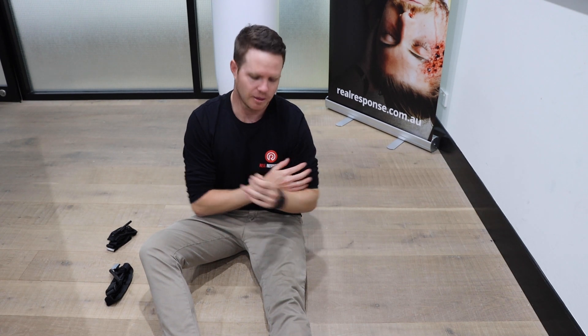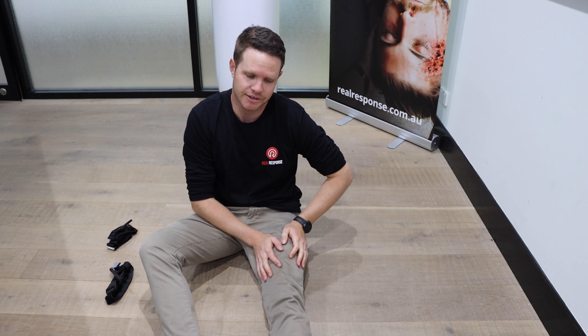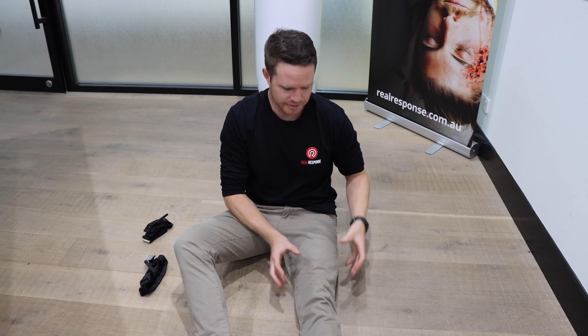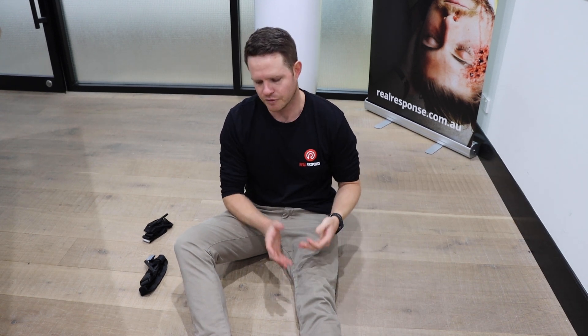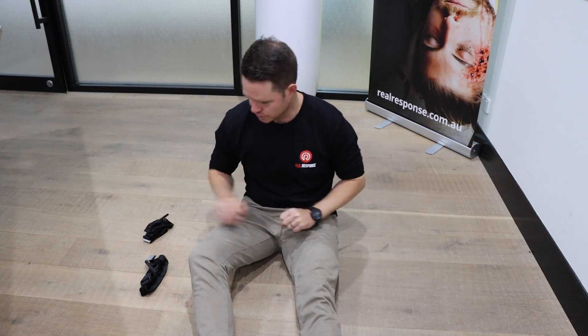The same principles for the arm apply exactly when you put it on the leg. Just be aware that the muscle in the leg is a lot larger than the arm. We may have to apply more than one tourniquet to the leg. If you have a double amputee and two of you are working on that patient, make sure you're pulling that tail away from each other, not towards each other - pulling away from the patient.